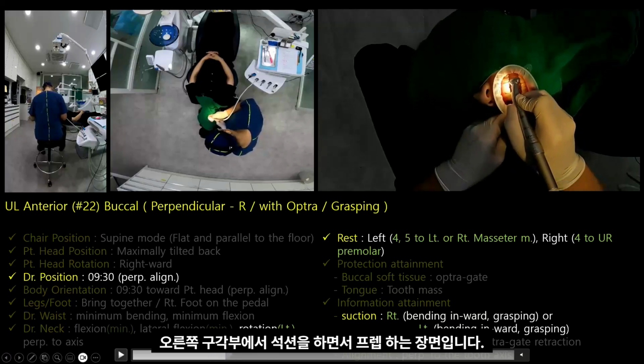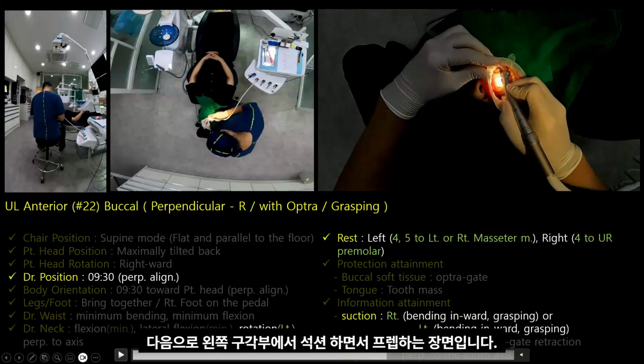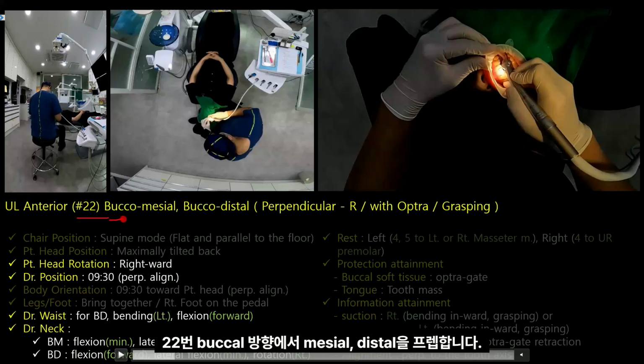This scene shows prep with suction from the right oral angle. Next, we will look at a scene where a prep is being done while simultaneously suctioning from the left oral angle. We will look at prepping the mesial from the buccal direction of tooth 22 and prepping the distal from the buccal direction of tooth 22.